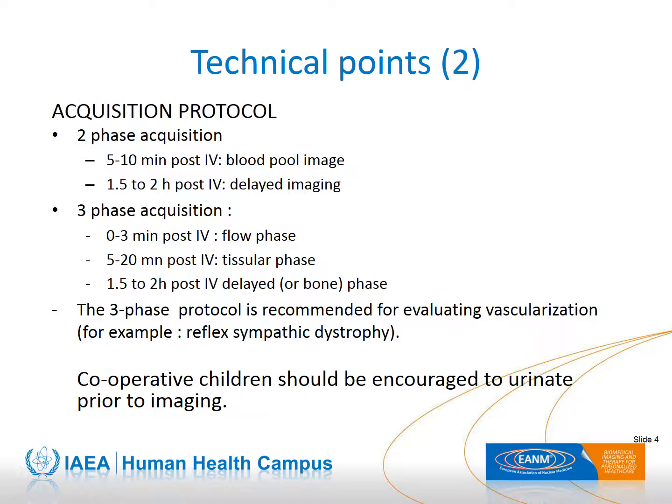There are cases, however, when the vascular phase is really necessary, for instance, in suspicion of reflex sympathetic dystrophy. Cooperative children should be encouraged to urinate prior to imaging.